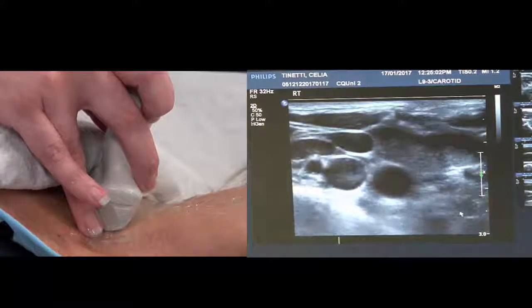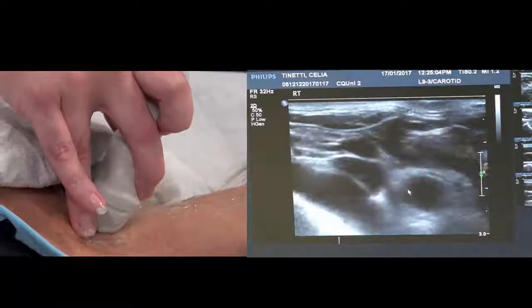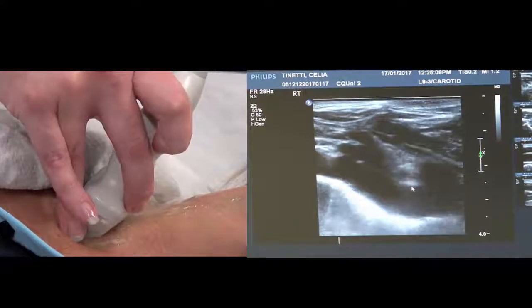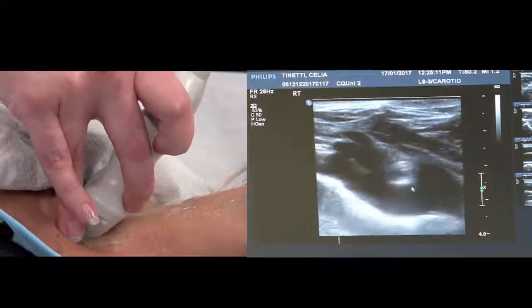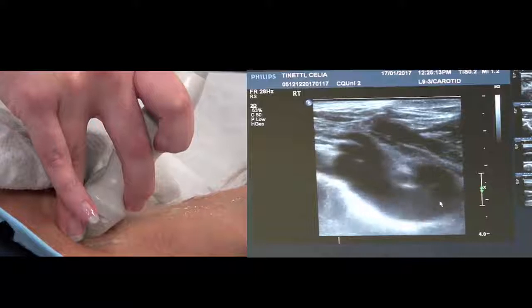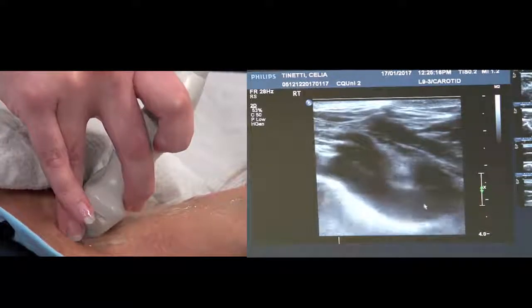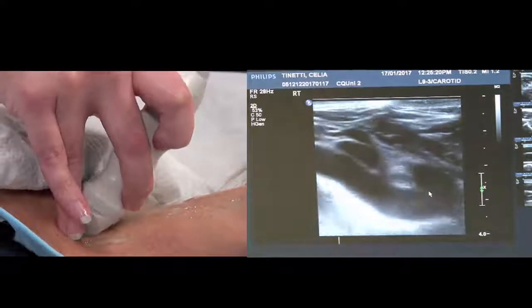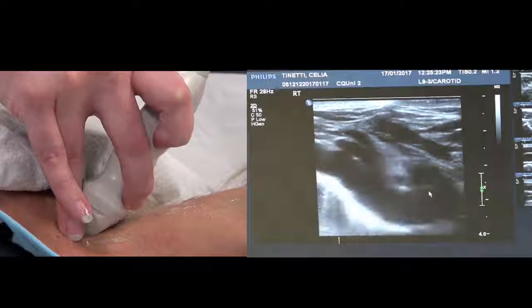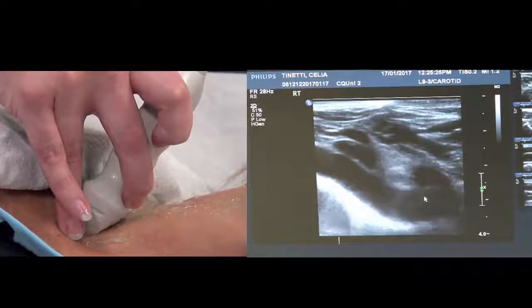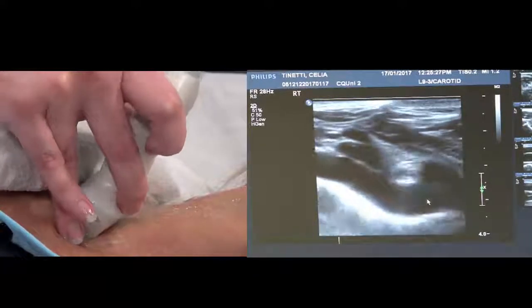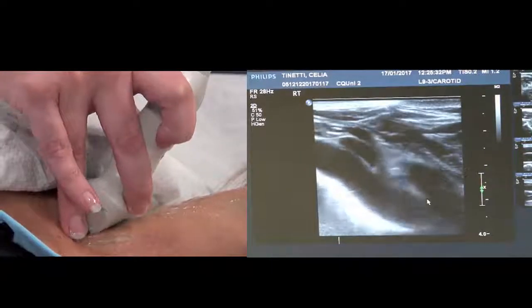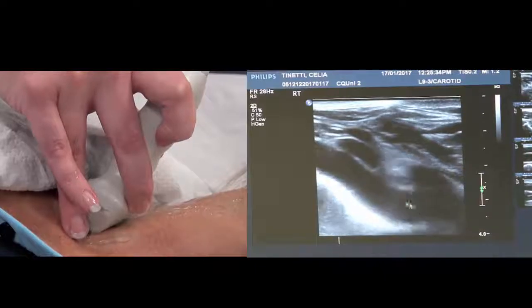Remember you're following the CCA down, you need to drop that depth. Now everyone's different. You can optimize your image — you can see on this person, here's the subclavian coming off here. Now you're not going to be able to get a 60 degree angle there. This is the area that is of highest importance though. So put the gain down a little bit — again you don't want it black. It's going to depend which way you can angle; every patient's different unfortunately.